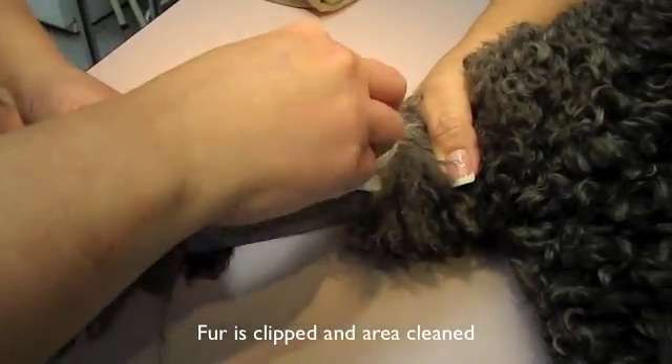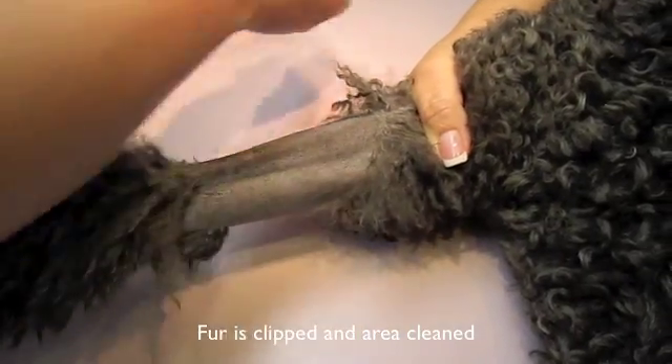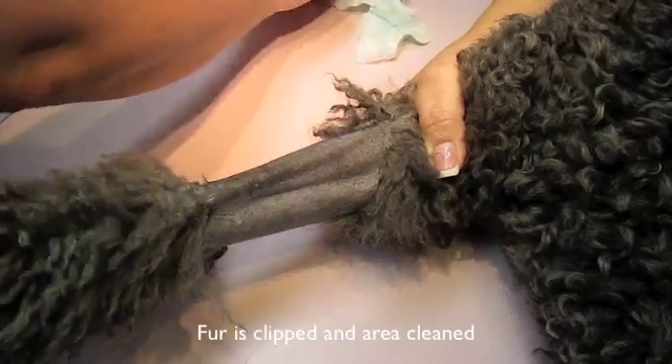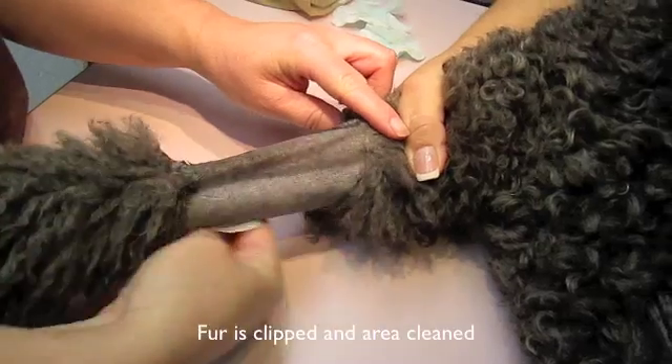The fur has been clipped here and now the skin is cleaned with an antimicrobial solution called Novosan. We are removing stray hairs, dirt, debris, bacteria — whatever it could be on a pet's skin.